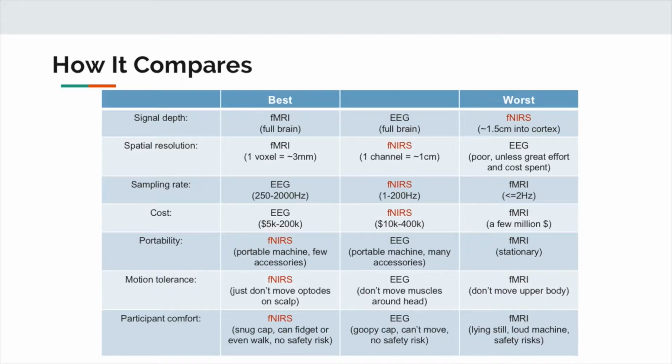It's in the middle in terms of sampling rates. It's much faster than MRI, but it's still dependent on the BOLD response, which we'll talk about a bit more in a sec, and that is inherently several seconds slower than actual brain activity, which is what EEG is measuring. The cost is around the same ballpark as EEG, sometimes a little more expensive, sometimes less.